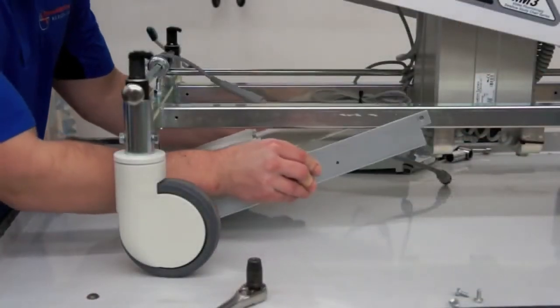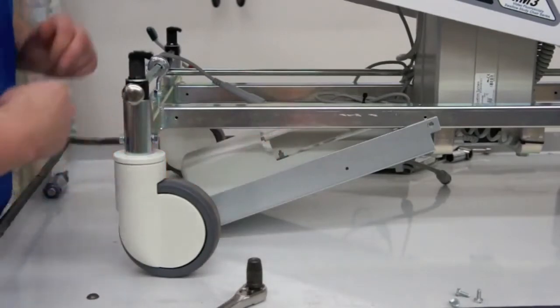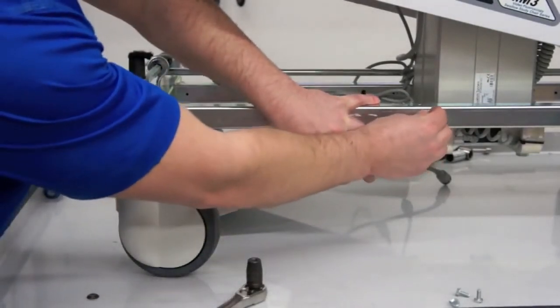Reinstall your control box bracket. Front end first, then back. Securely tighten all four screws.